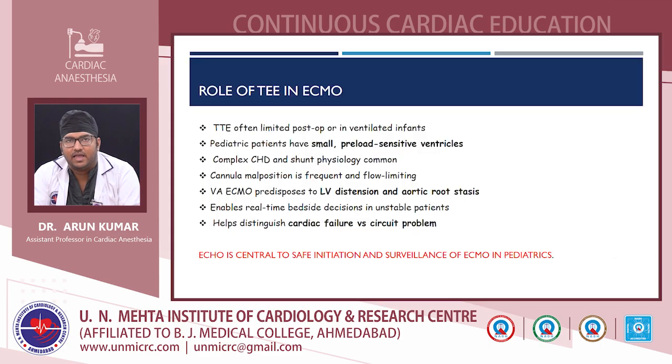So next comes ECMO. So the role of TE in ECMO. TE is often needed because transthoracic echo is often limited post-op or in ventilated infants. Pediatric patients also have a small preload-sensitive ventricle, and complex congenital heart disease and shunt physiology are very common, and cannula malposition is frequent, and there is flow limiting. And VA ECMO predisposes to LV distension and aortic root stasis.